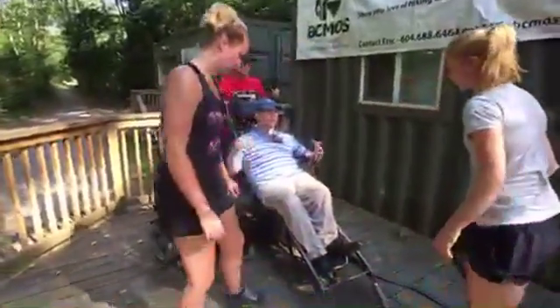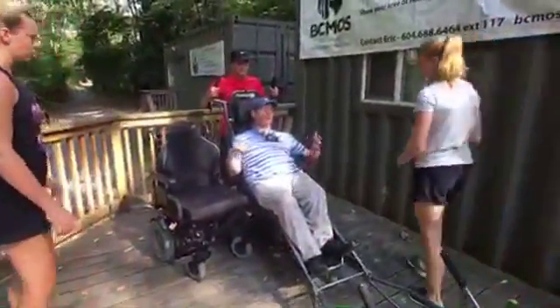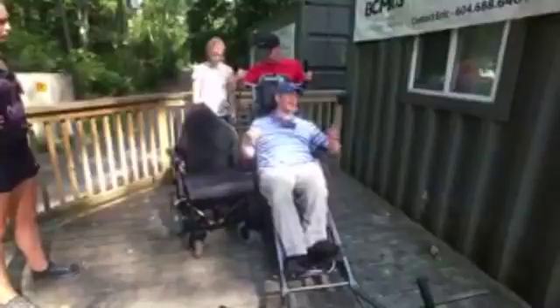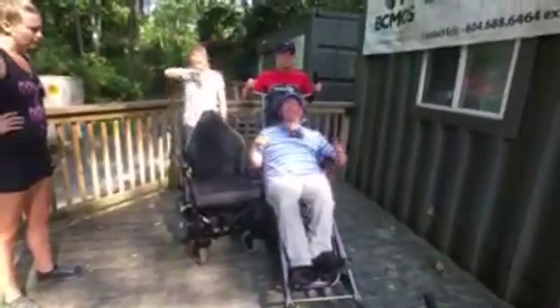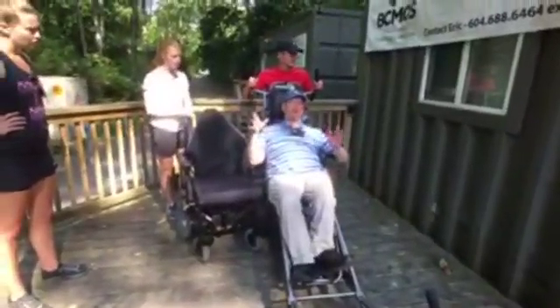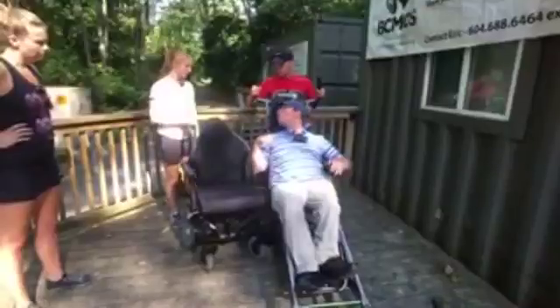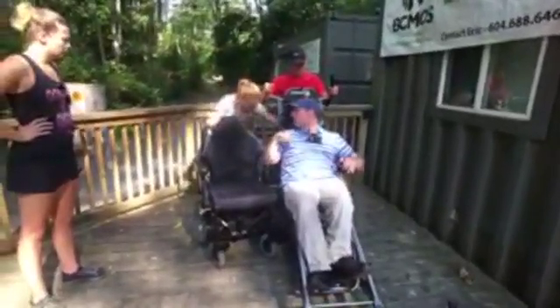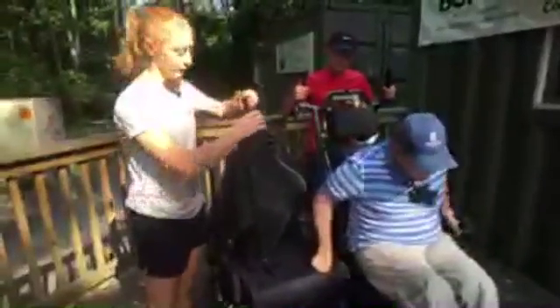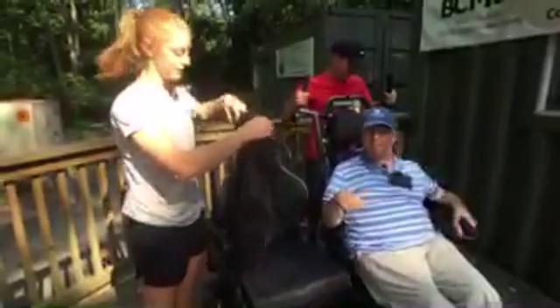All right, so we've got those back on. So another thing we should mention is you can see I'm a, shall we say, full-grown rider, but for those of kids or of a smaller stature, we also have an insert that can help shrink the seat, so you don't feel like the seat's too big for you. Can you show we that have insert, Alex? This child insert here. And so this attaches into the back of the Trailrider and just helps make it a little bit more snug for a smaller rider. So that's something we can insert as well.